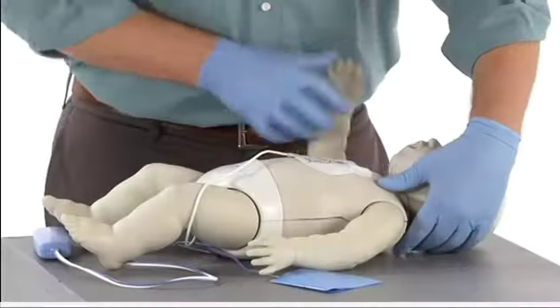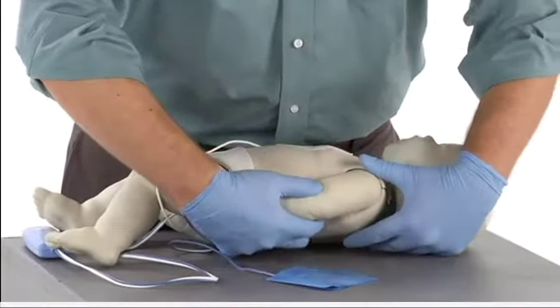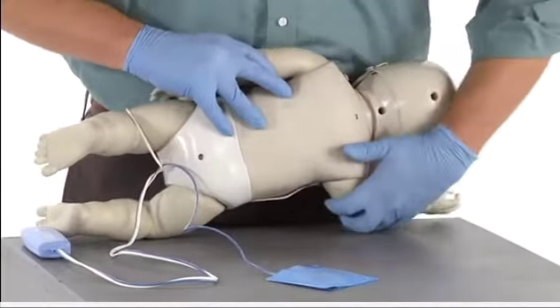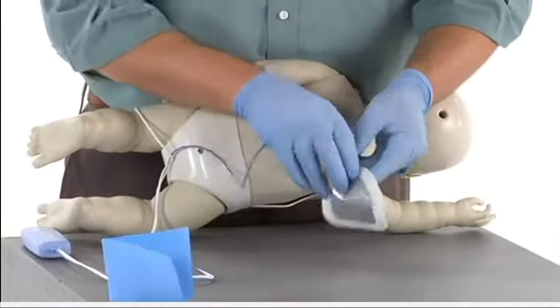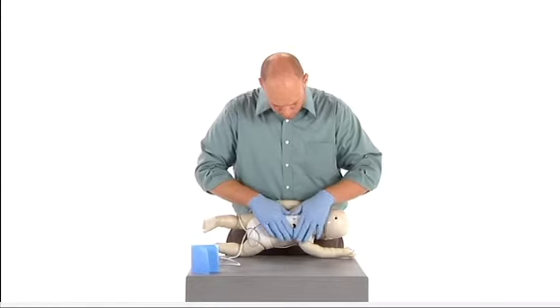For a small child or infant, the pediatric pads may be too large to fit on the chest without touching each other. You may need to attach one pad on the center of the chest and the other on the back between the shoulder blades.